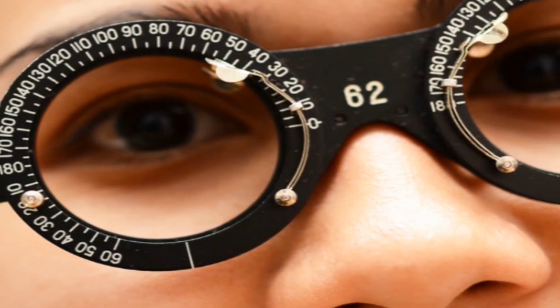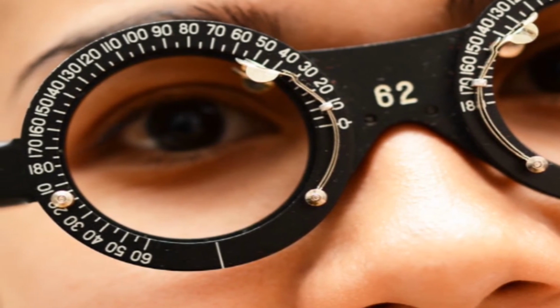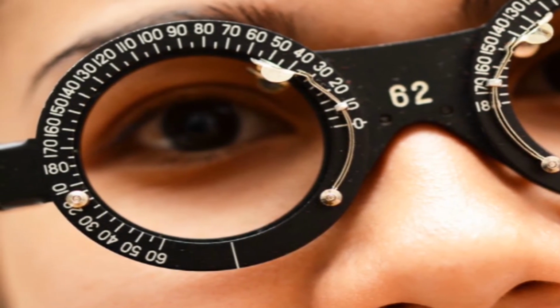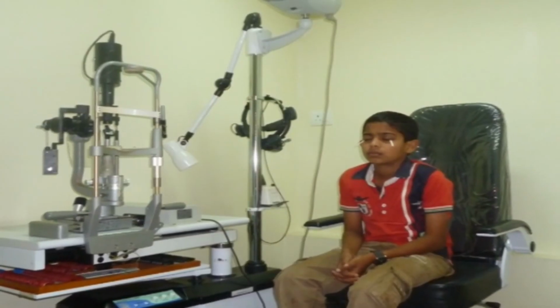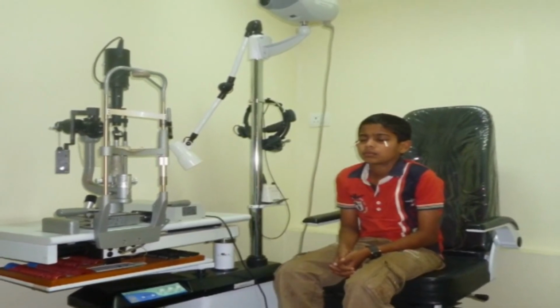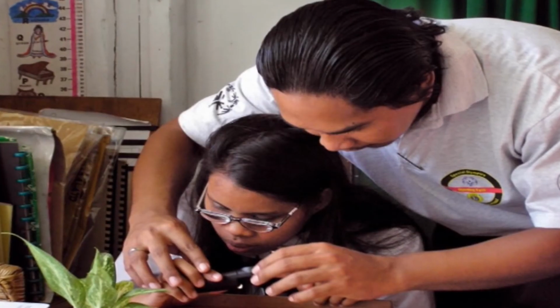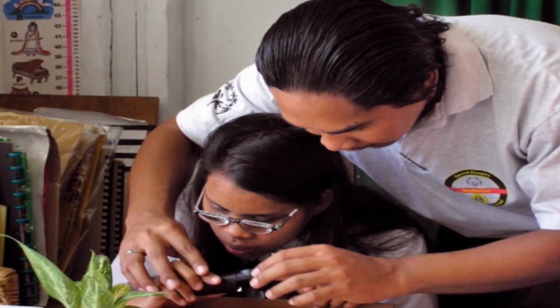Training in the use of low vision devices is critical and home trials of low vision devices are advisable. These should be arranged immediately after the initial assessment. Children should attend their first follow-up visit 3 to 6 months after their initial assessment. This will ensure that they have enough time to try the prescribed low vision device at home and at school. Because visual requirements change with age, children should attend follow-up visits once in 6 months.